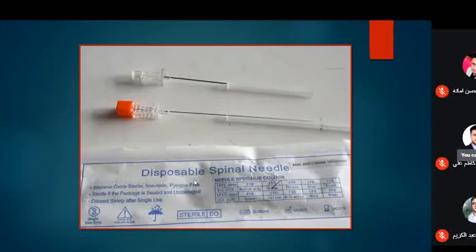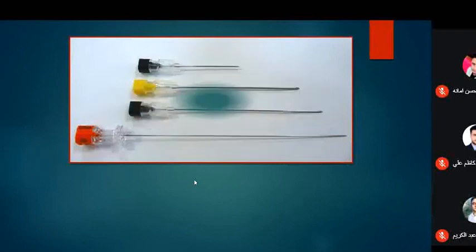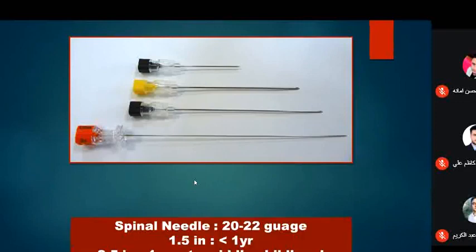And of course, we know the spinal needle and its main use is in lumbar puncture. We have different sizes of spinal needle, like the cannula, starting from the size that can be used in the neonatal period, reaching to the adult.